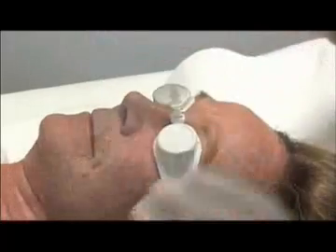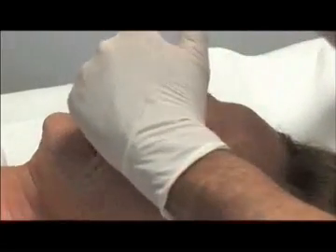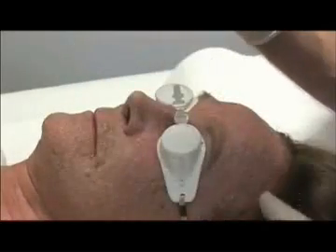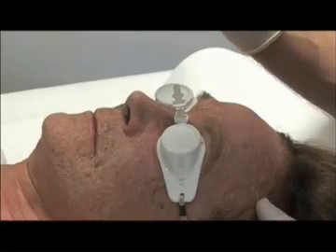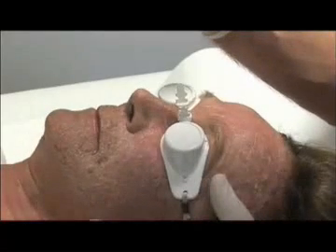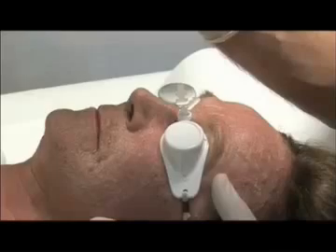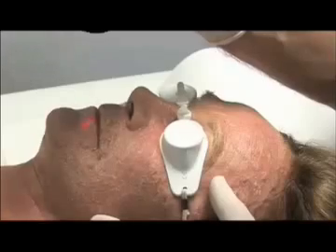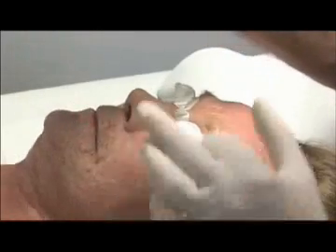We keep the filter on as we're going to work on it again afterwards to hollow out the ridge further, but we will do this later on. Now we're on the lower lip and chin. These are the most painful areas.